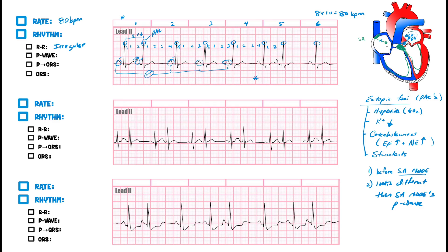Continuing through the strip: normal P wave, same, same — and there's another PAC. How do I know? Decreased R-to-R interval — it came early — and the P wave looks different. PACs are important because you can have them and be completely asymptomatic, but sometimes you can have palpitations.